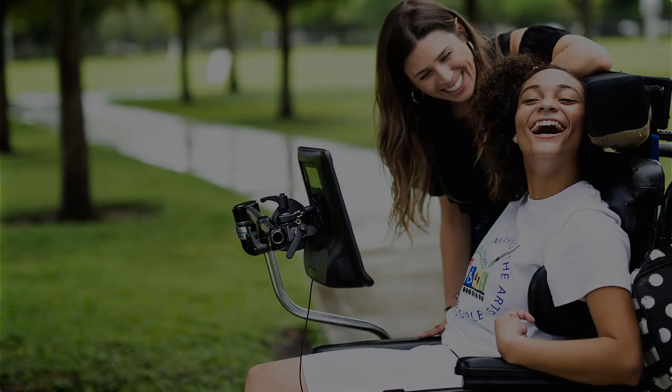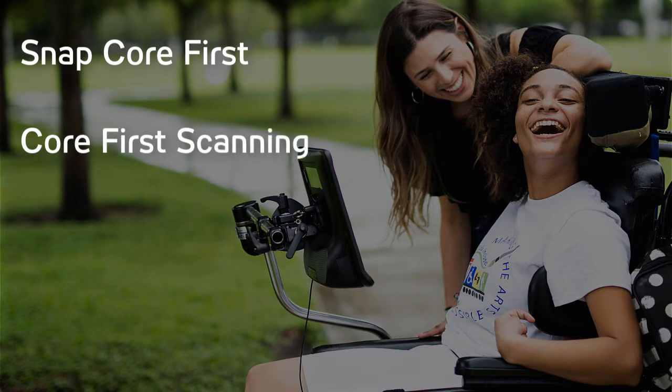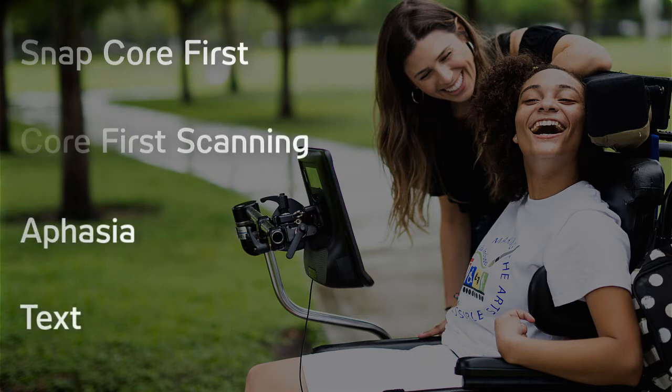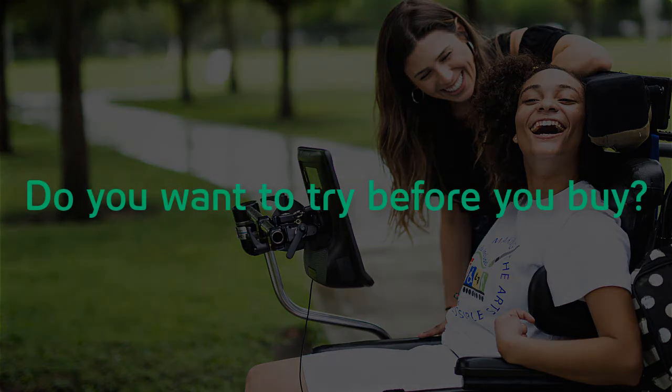Are you a family member, parent, or caregiver of someone who would benefit from using SNAP with the Core First Page Set, Core First Scanning, the Aphasia Page Set, or the Text Page Set? Do you want to try before you buy?